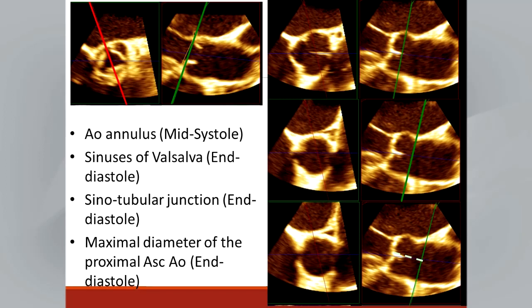The outer to inner is larger, and all of the parameters that show the cutoff values use this previous convention of measuring from the outer to the inner side. And I think it's very important to understand that we did not want to change it, because all of these guidelines regarding when to operate on the aortic root are based on these measurements.